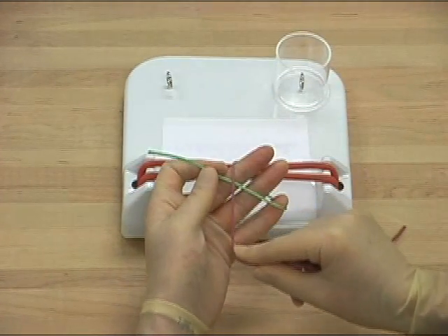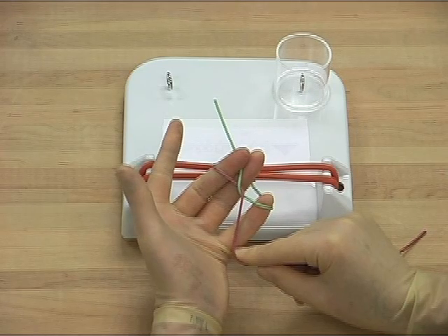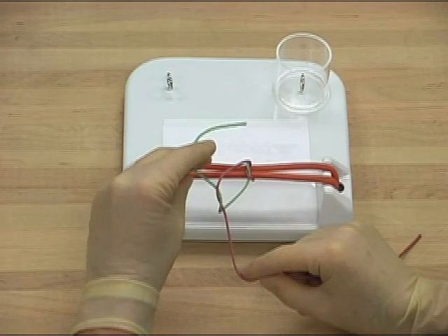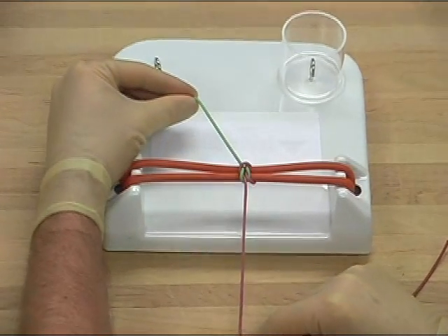The suture is crossed over the fingers of the tying hand, and again the free end delivered back into the fingers of the holding hand, bringing the end through the loop so created. This time the free end is pulled away from the body, thus creating a square knot.